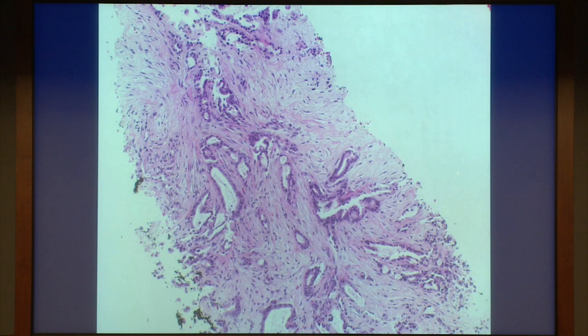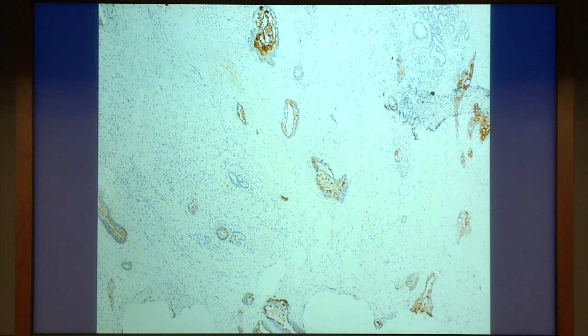This is a fantastic amount of tissue. It is very easy on H&E, and at one quick glance, we can make a diagnosis of adenocarcinoma. Wonderful. And there is some tissue left in this core, which is about 3 millimeters thick at the most, for assays to be done. But you can imagine if you first send it for Oncomine and then later on want something else for a specific trial, you could easily run out of this tissue.